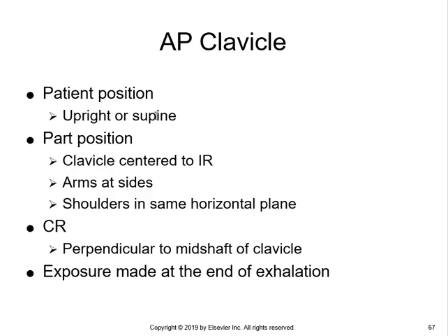So patients can be upright or supine. The clavicle of interest should be centered to the image receptor. The arms at the patient's side, shoulders in the same plane. Central ray to the midshaft of the clavicle. Make the exposure at the end of full exhalation. So have the patient blow all their breath out and stop breathing.